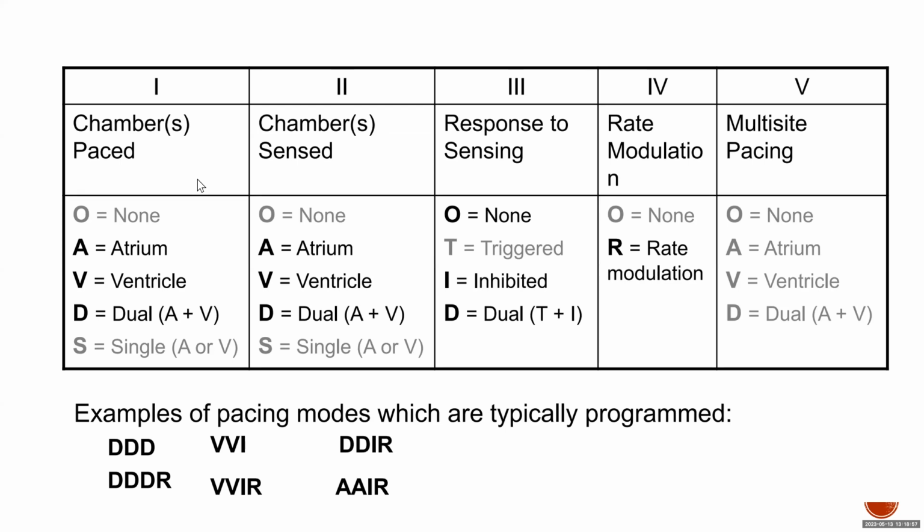Yeah, exactly. When you fear that something will interfere with the pacemaker and the pacemaker will think there is activity, for example electrocautery, so you want the device not to sense anything. Pacemaker-dependent patient, you just say, just pace all the time. Don't look for anything, because I know the patient has no underlying rhythm, and I'm worried that electrocautery will be interpreted as intrinsic rhythm. So I'm just going to program it as VOO. Good, excellent. Any questions?